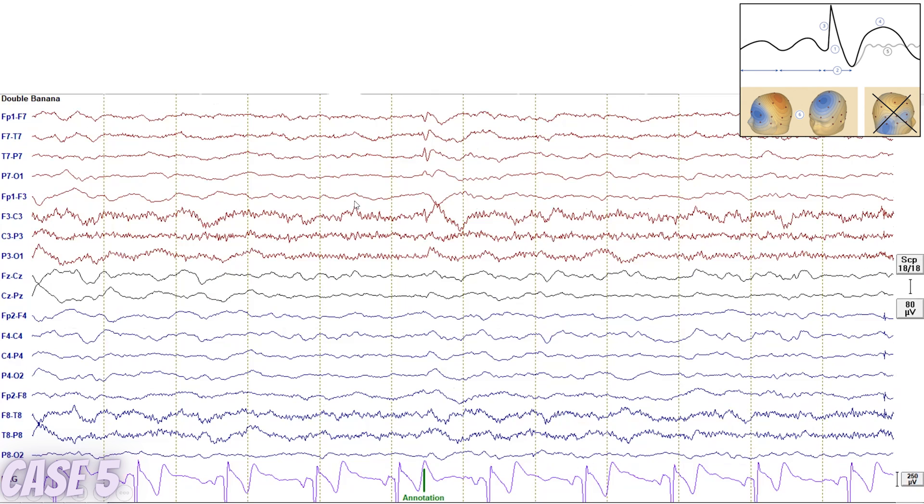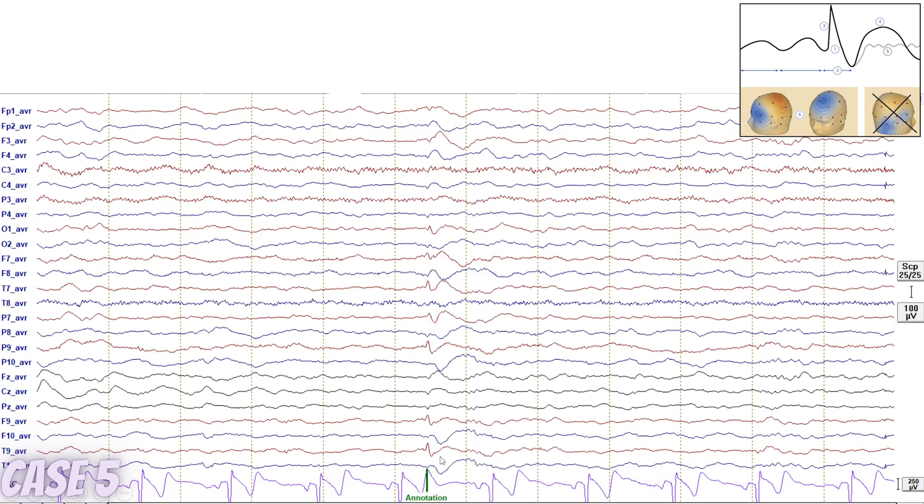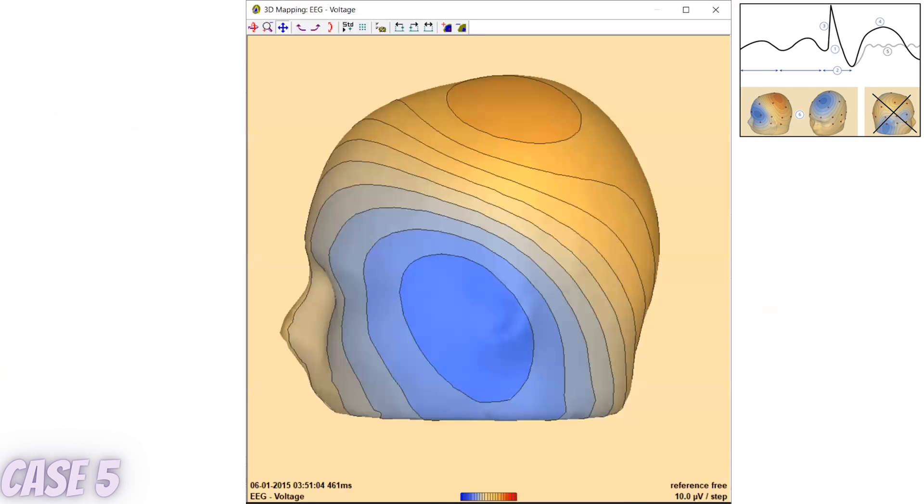Got it. So what do you think about this one? Randy, want to go? I mean, it is spiky. And again, always with number two - or sorry, wave duration - I think the wave duration is different. The asymmetry, I really think it's not asymmetric, but I'm never confident about that. Look at it now in a common average. Yeah, I mean again, so I think if I measured the slope it would be about the same. Obviously the downgoing segment is longer, so maybe that makes it look a little steeper, right? But the criterion for - then the following slow wave, it has one. Yes, a nice one. Yeah, it has a nice one. Perhaps one to talk about the disturbance, number five. Yeah, I just wanted to look at number five. I don't think it's really disrupted here honestly. No. You could argue there is some beta at the end of the slow wave, but you can see that the same - I think it's present elsewhere too.